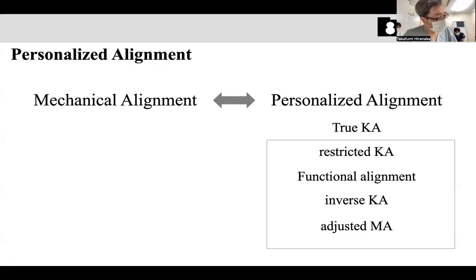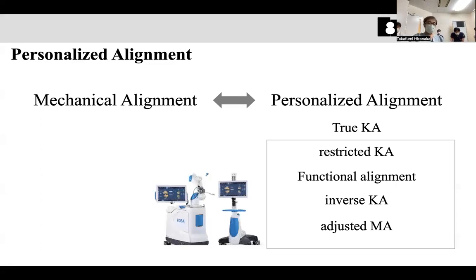Anyway. So we need computer-aided devices. That is a problem. So anyway, this is my challenge: how to perform the restricted kinematic alignment.